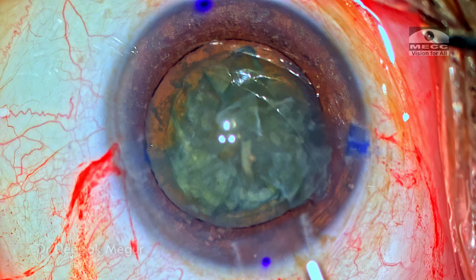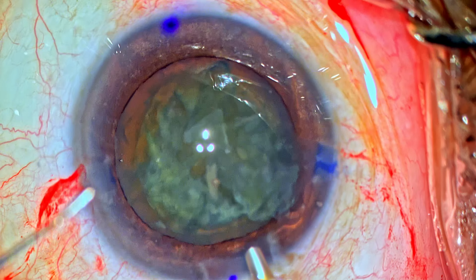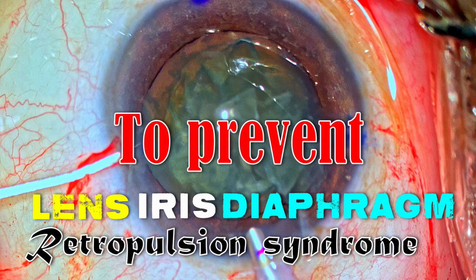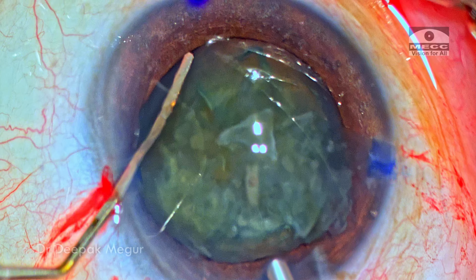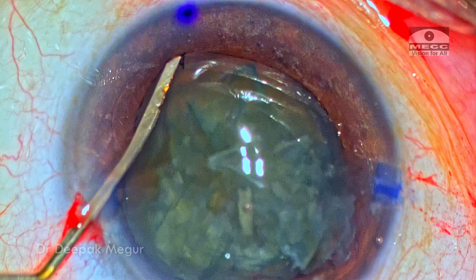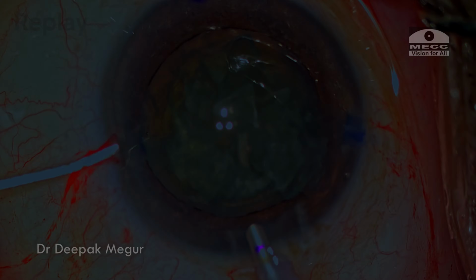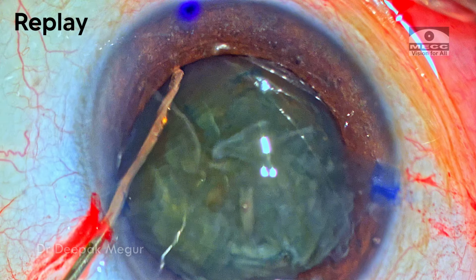I'll be now introducing the phaco probe into the eye. Now this is the moment when we'll have this evidence of sudden deepening of the chamber secondary to the reverse pupillary block or the LIDRS. To prevent the lens iris diaphragm being pushed down suddenly, we have to lift up the iris. So I switch the Sinskey hook which is there with an iris repositor which goes in first and it is placed under the pupil, and the iris is lifted up as the phaco probe is introduced inside the eye along with the irrigation. So this ensures that the sudden deepening of the chamber is prevented, and basically we are going to avoid the occurrence of the reverse pupillary block.